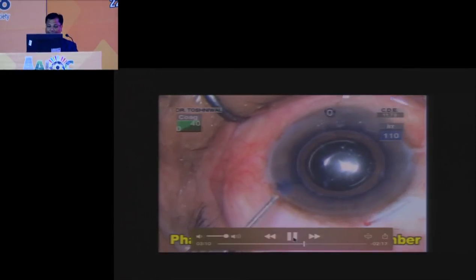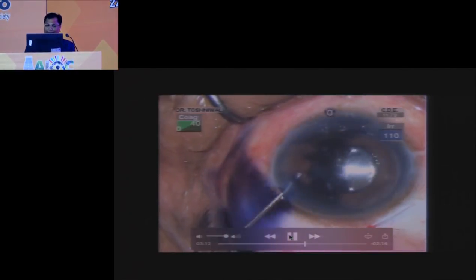This is all very easy in this situation, but you have to remove viscoelastic because it may give inflammation and all that. Now this is a case of another situation, the shallow anterior chamber. Shallow anterior chamber is a really big challenge. Whatever machine you have, because the space is very small, if you do not select the indicated cases for this situation, you may damage the endothelium. So this is a very interesting situation, and you have to be concerned with many findings.